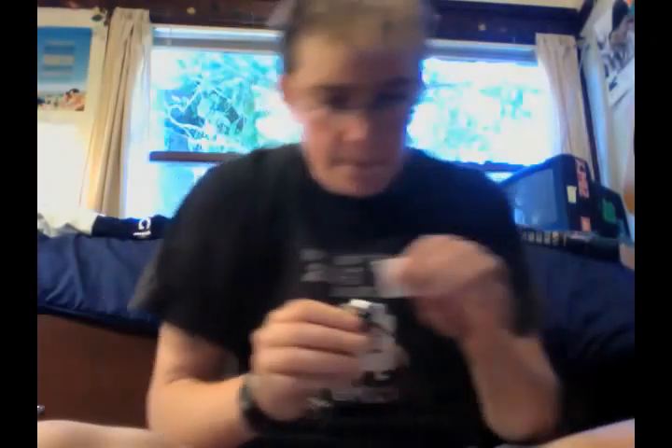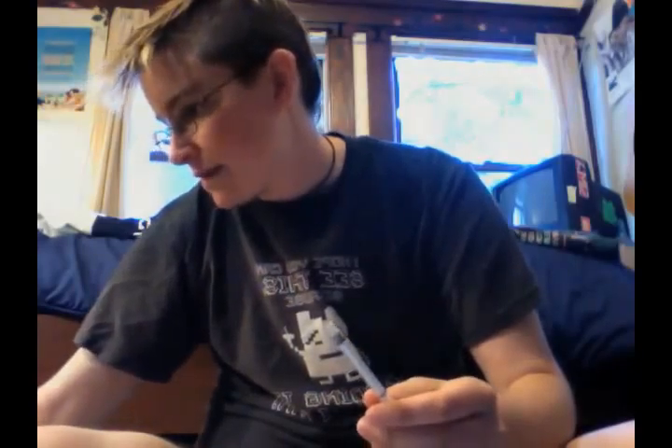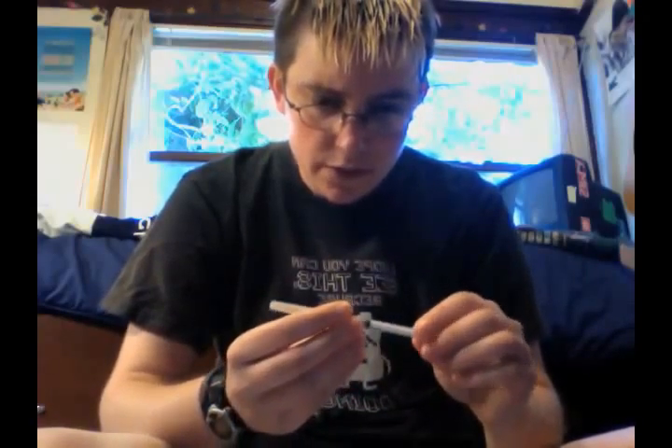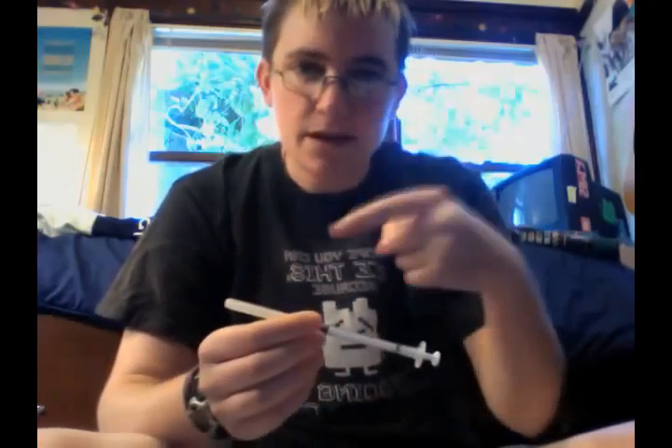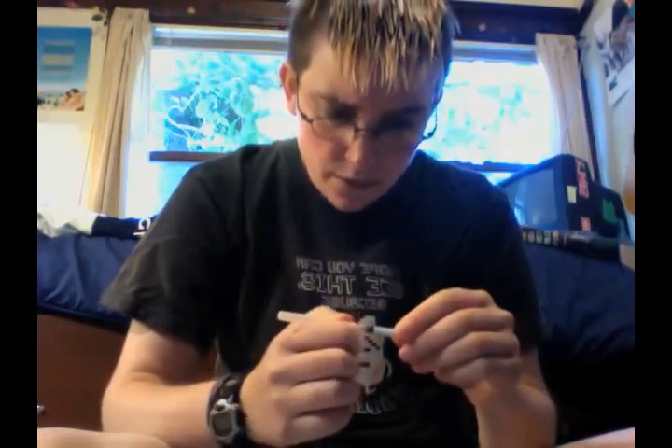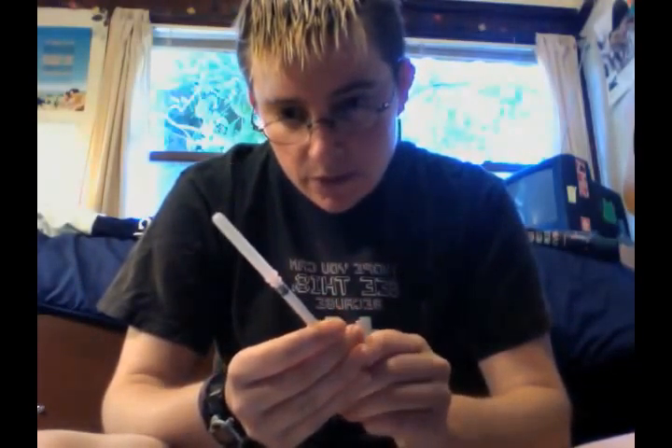I'm like nervous right now. Might be because I'm recording it, but it's probably because I haven't done it at home before. Okay. Put on the 18 gauge needle. So this is a 1ml syringe. My dose is a quarter of an ml, so 0.25. The one at the clinic has rings on it to twist it on, but I'm gonna say that's on. It's a little scary.